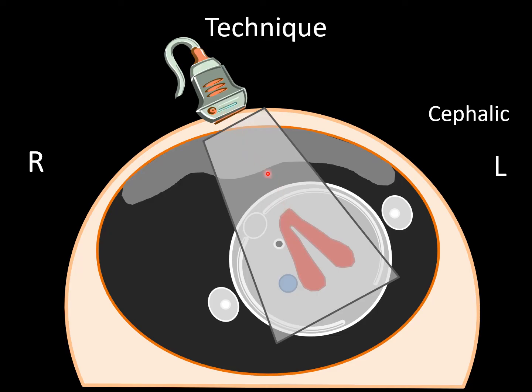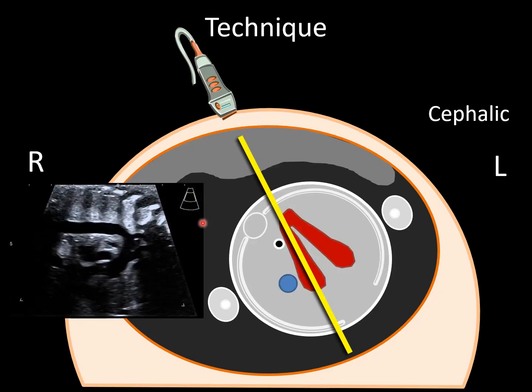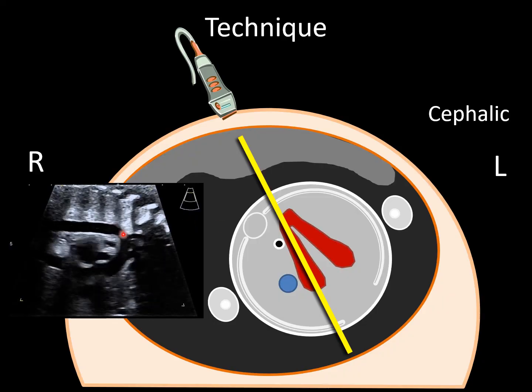The V is pointed to the center of the sector, whether it's inverted, where you have an anteriorly facing fetus and the V facing the other way, or in this case with the spine up. You can always align this in a way that will get the V in a parallel format. And then from there, you're going to rotate your transducer to transect, in this case, the aortic arch in a nice long axis format.